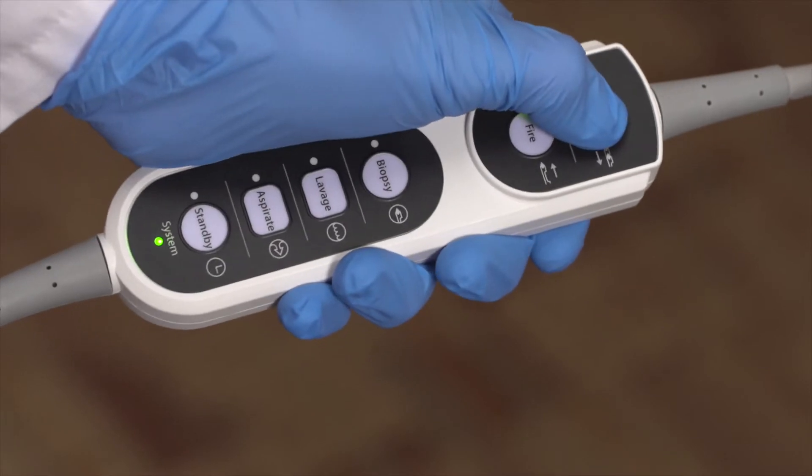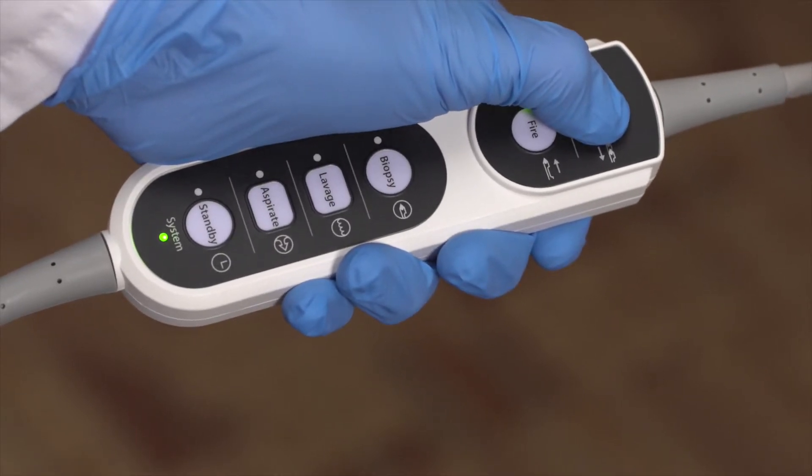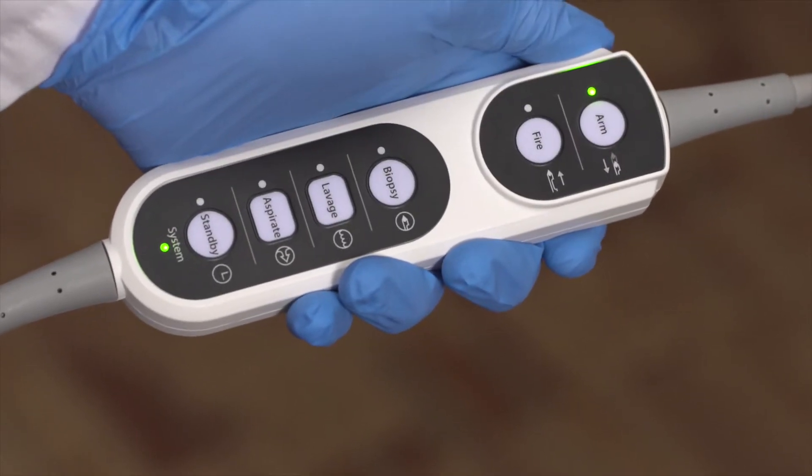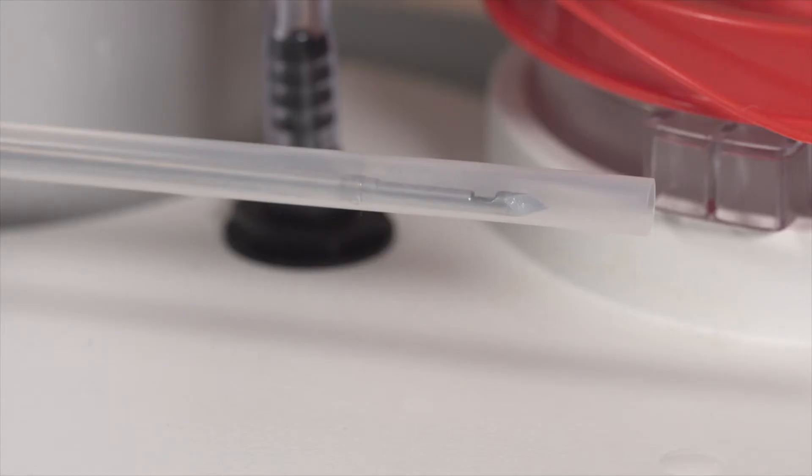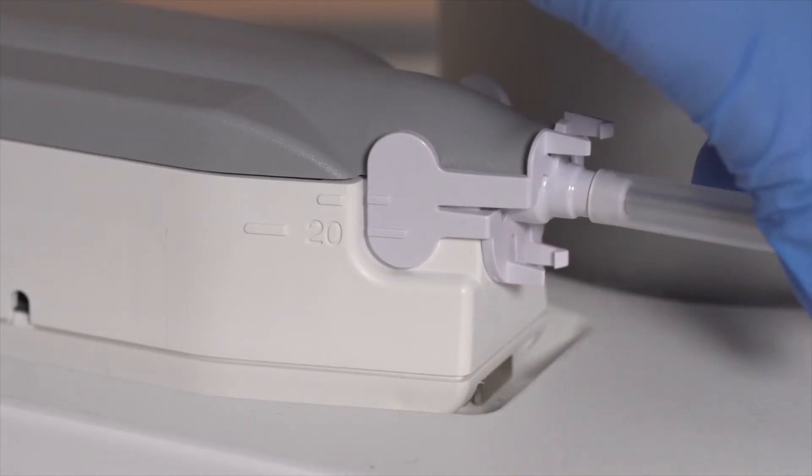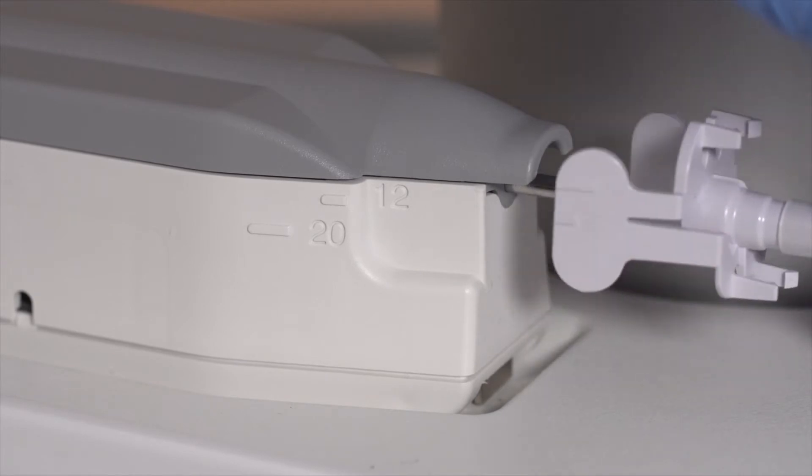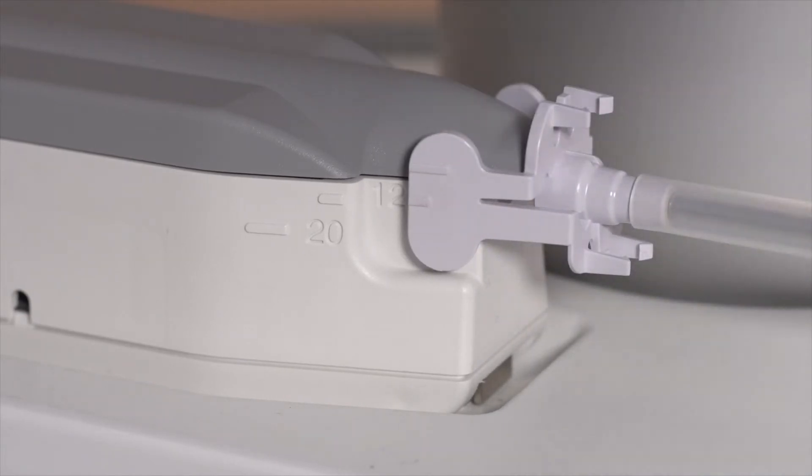The biopsy device should always be armed before placing on the imaging guidance system. Arming the device sets the appropriate firing stroke: 23mm stroke for standard and 15mm stroke for petite. If the position of the sheath is changed to change the aperture setting, remember to fire and rearm the device so the correct stroke is realized.